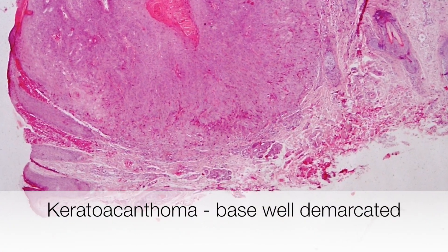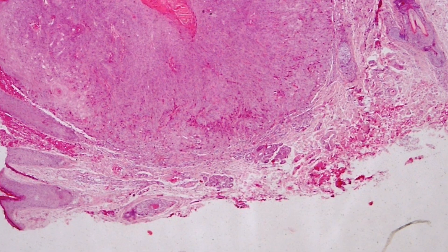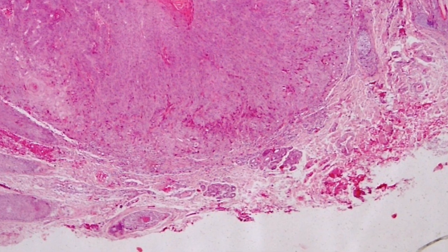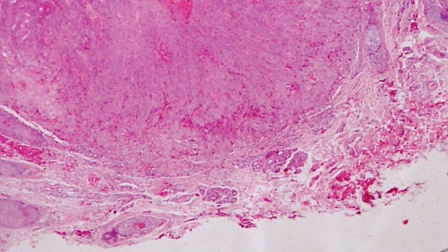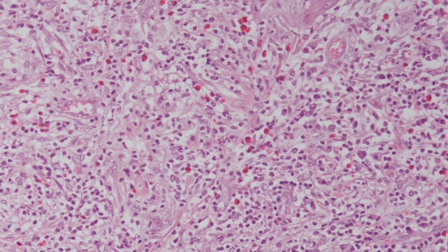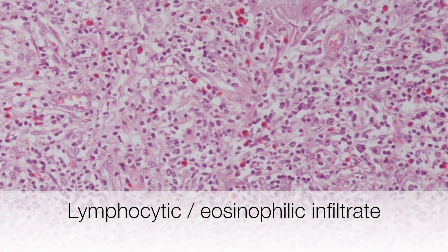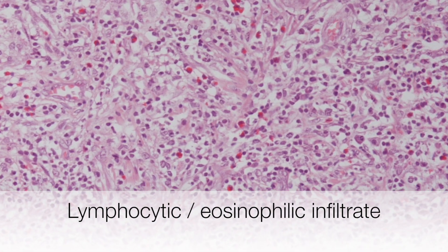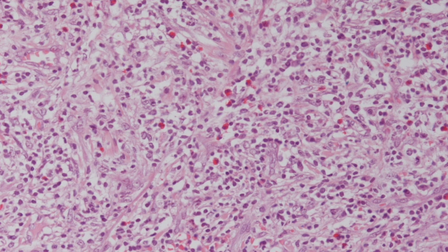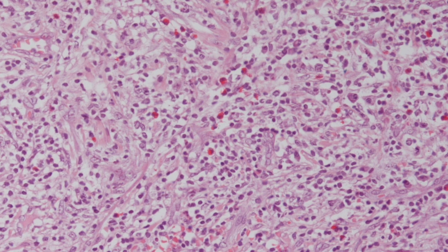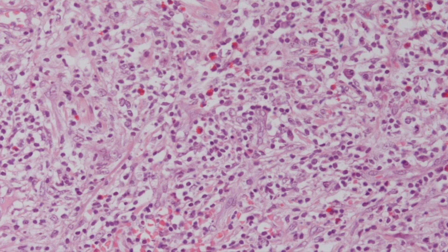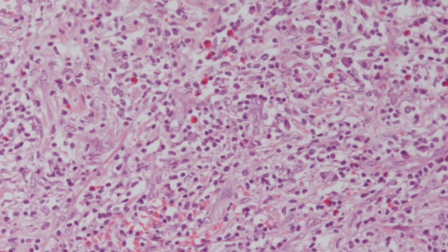This is the dermis at the base of a keratoacanthoma. It contains a dense infiltrate of lymphocytes and eosinophil polymorphs.